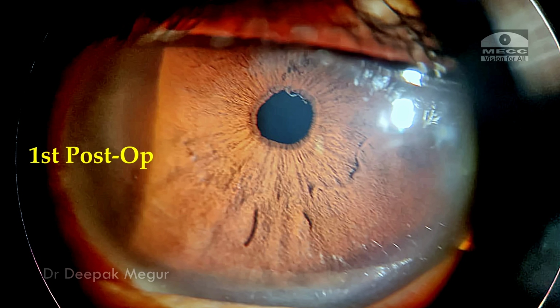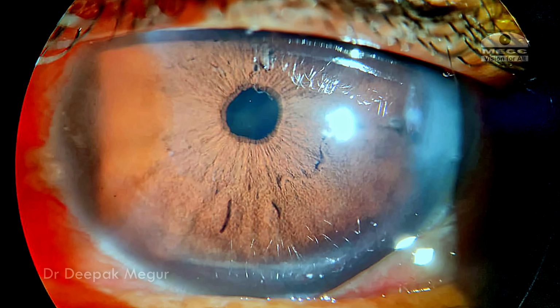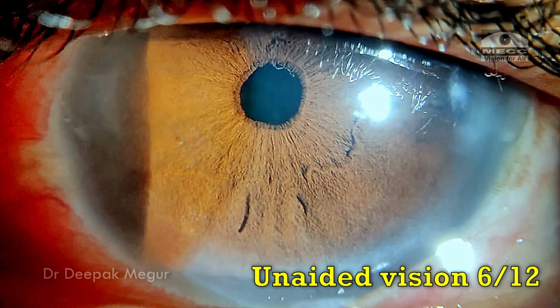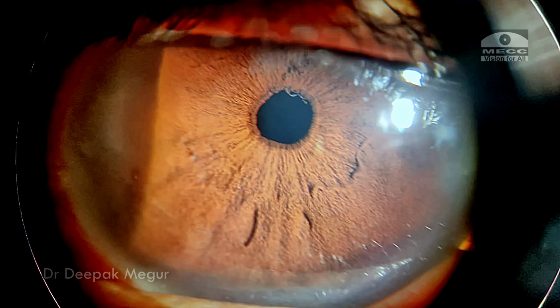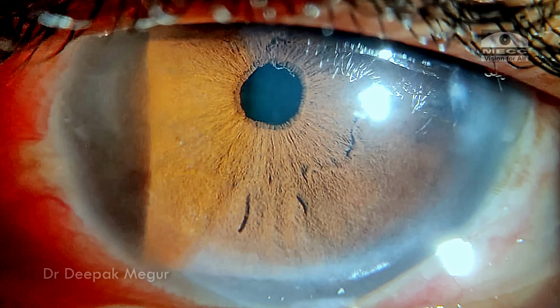These are the first day post-op pictures. The eye is quiet, there's no inflammation, the lens seems to be well centered, and the uncorrected visual acuity is 6/12, and the patient is quite happy because she was counseled of a very poor visual prognosis, but she was quite happy with the outcome.